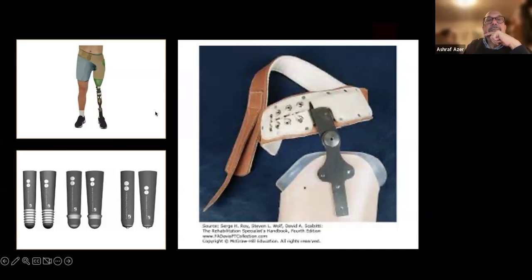If the patient walks with Trendelenburg without a belt, that means that he will fall all the time he moves or swings his leg, if he has to supplement it with an extra force here around the gluteus medius area. Okay? For people with weak gluteus medius, we prefer to give them a rigid belt, or a soft belt if they have a reasonable 3/5 on the Oxford scale. But people who can control their movement within the socket, we can use one of them. Is that okay?